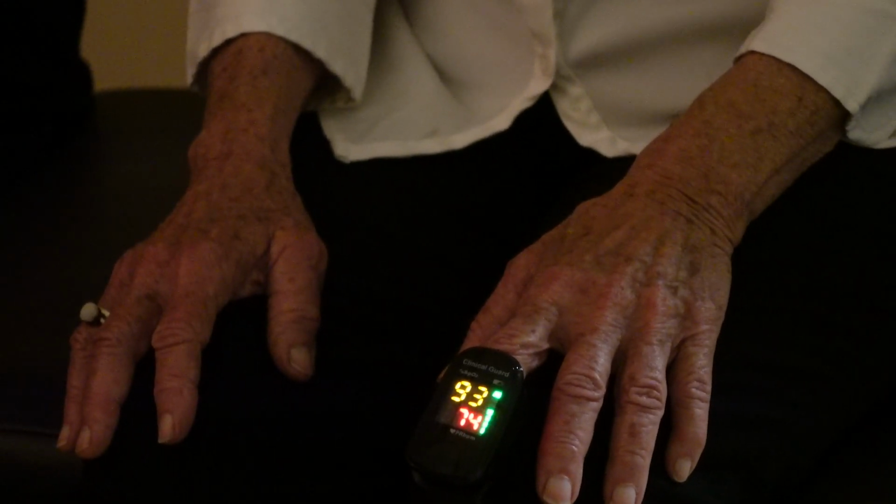So when you look at the pulse oximeter reading, you can see that the tissue saturation of oxygen is really poor, and she's really not taking a normal breath, and her chest cavity isn't moving. But even more importantly, if you look at her heart rate, we have her visualize movement to the left and to the right, and when she visualizes moving to the right, we can definitely see her heart rate go up. So this is a reflection of how much her vestibular system is impacting her autonomic function.